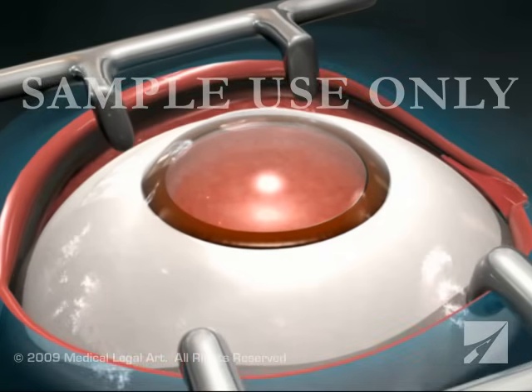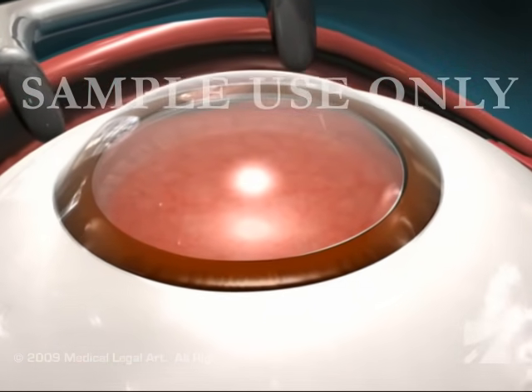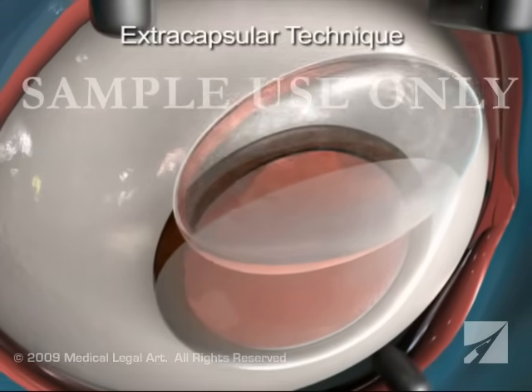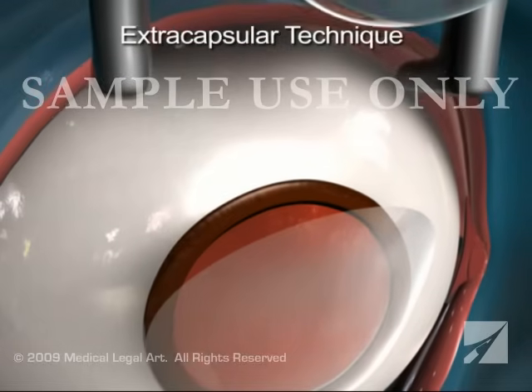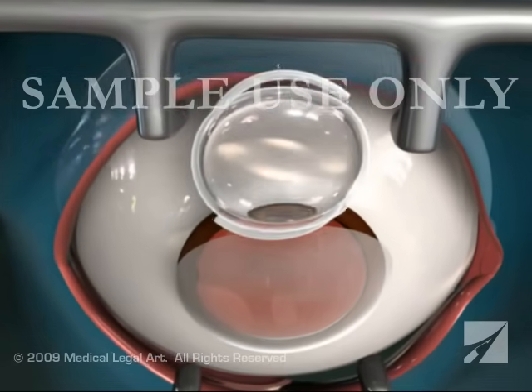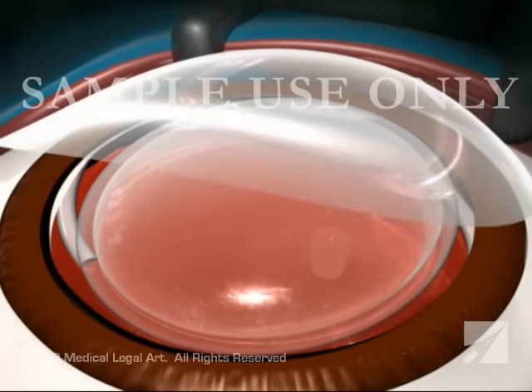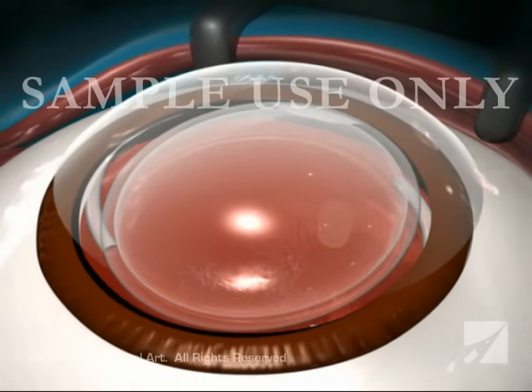Another method for removing cataracts is called the extracapsular technique. In this procedure, the incision made near the cornea is large enough to remove the cataract in one piece. Again, an artificial lens is inserted to replace the natural lens. Recovery from this type of cataract surgery is usually slower.